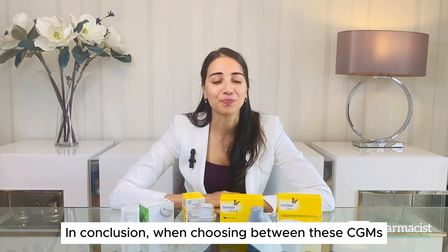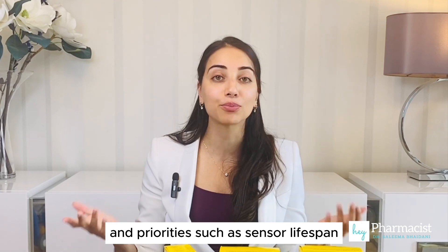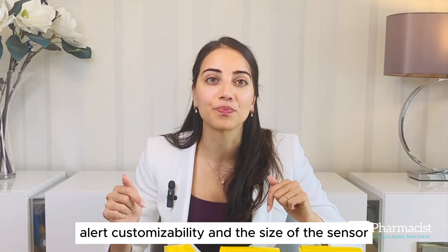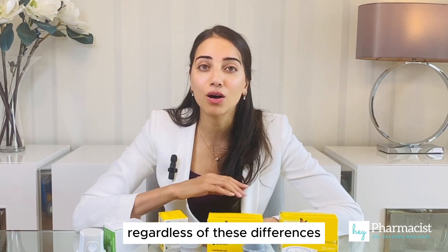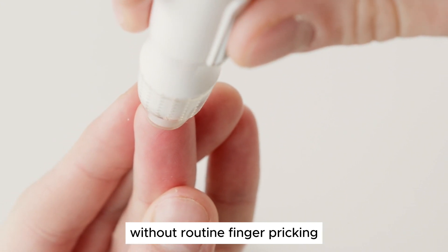In conclusion, when choosing between these CGMs, it's important to consider personal preferences and priorities, such as sensor lifespan, alert customizability, and the size of the sensor. Or at the end of the day, it may simply come down to price or what's available in your country. Regardless of these differences, all of these devices offer the convenience of glucose monitoring without routine finger pricking.